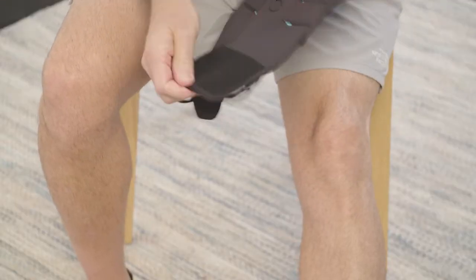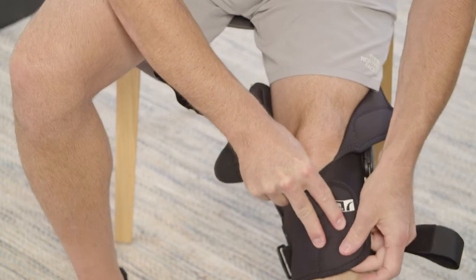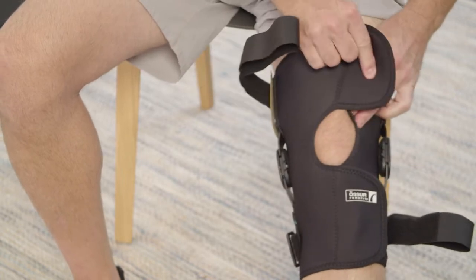Make sure all straps are unfastened. Open the soft good and place behind the knee. Wrap the soft good around the leg, lower portion first, and fasten firmly with the contact closures.